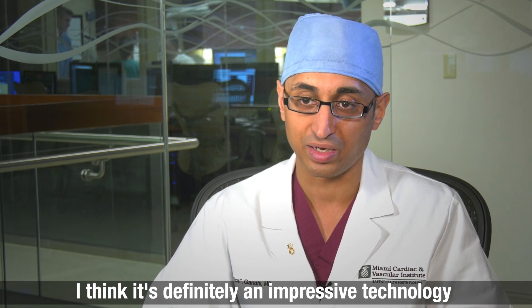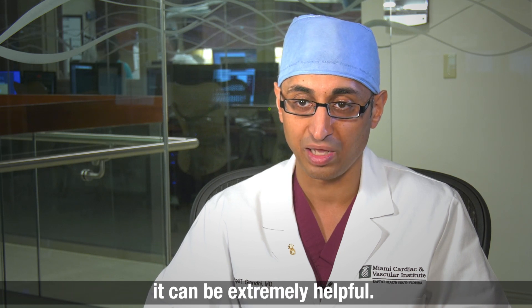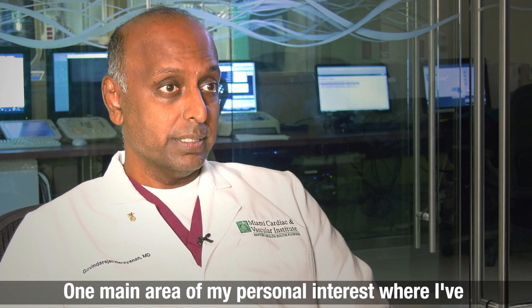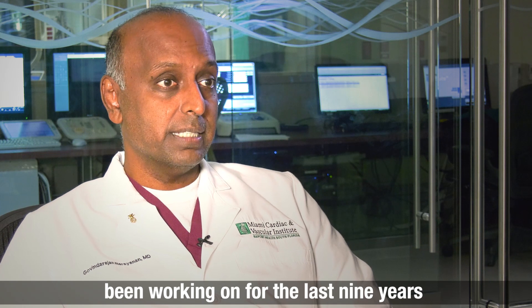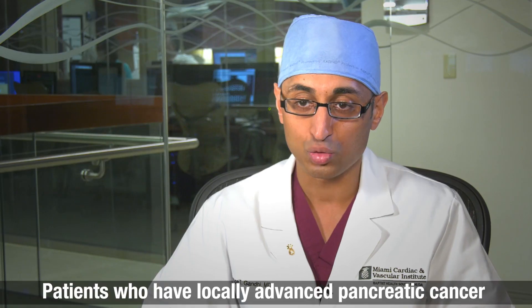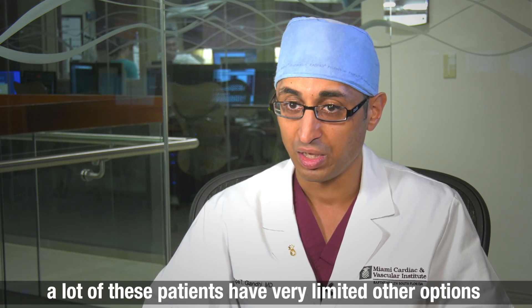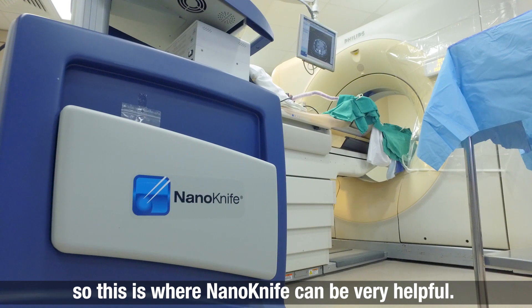It's definitely an impressive technology. It's not used for everybody, but for the right patient it can be extremely helpful. One main area of my personal interest — what I've been working on for the last nine years — is the role of NanoKnife in the pancreas. Patients who have locally advanced pancreatic cancer have very limited other options, so this is where NanoKnife can be very helpful.